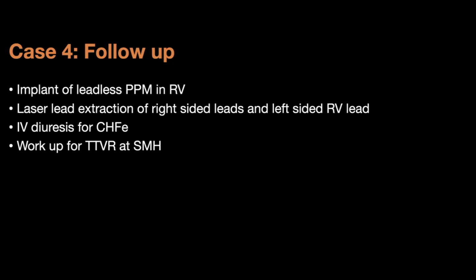And so the initial worry was that in some of these patients, when the laser lead extraction is done, they get into bad RV failure or heart failure because you can disrupt the tricuspid valve as you come out. But in this case, it's so wide open that nothing changed. What we're seeing with the TTVR is that paravalvular regurgitation can be an issue, particularly around where the pacemaker leads are. And that's another tip for the sonographers: if you see a pacemaker lead with a TTVR, really hunt and scan around it, because if you're going to find paravalvular regurgitation, it's probably going to be around there.